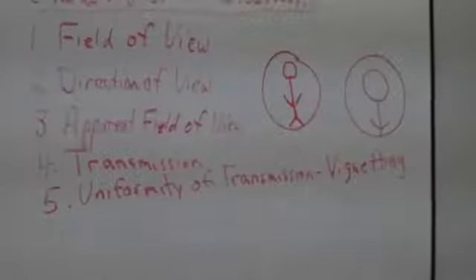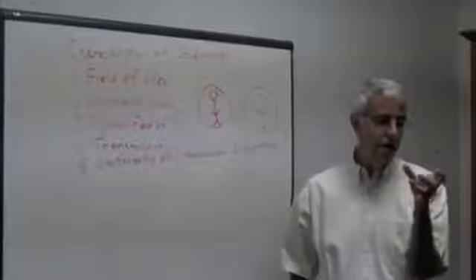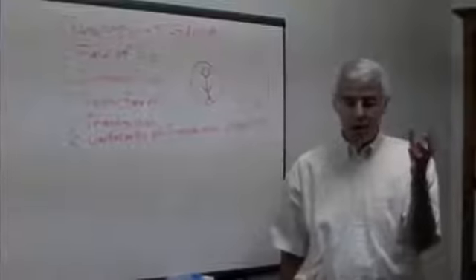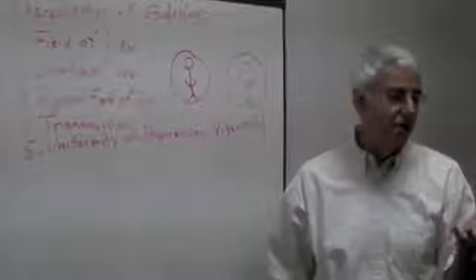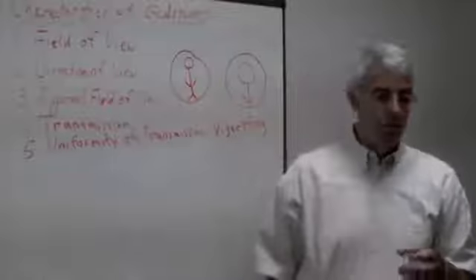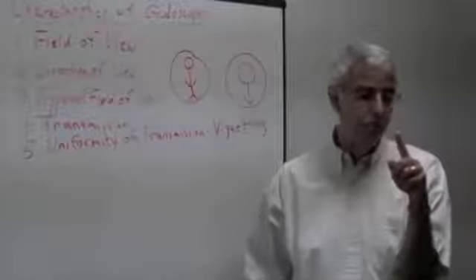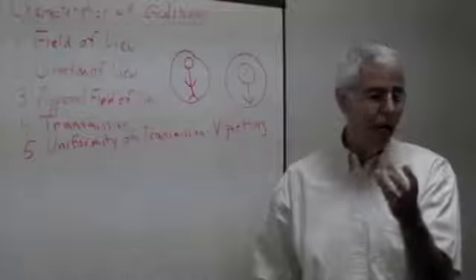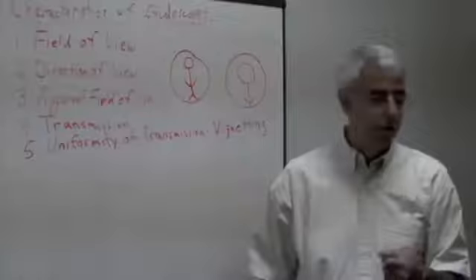So again, the surgeon says, got the scope repaired, yeah, I can turn the light up and I can see what I need to see bright enough in the center of the image, but I used to be able to see what was going on at the edge of the field, and now I can't. It's always dim. And if I turn the light up more and I can see what's going on at the edge of the field, well, now the center of my field is saturated, and I've got a whiteout condition. I can't see anything. It's too much for the dynamic range of the camera.